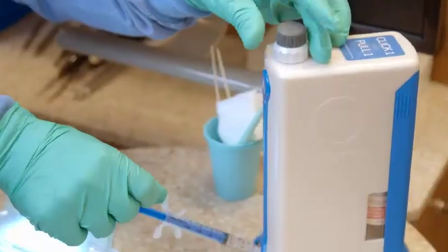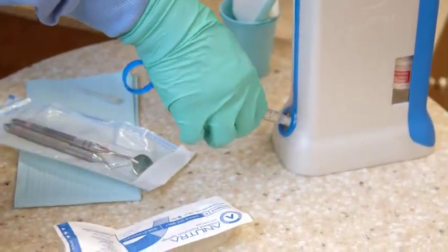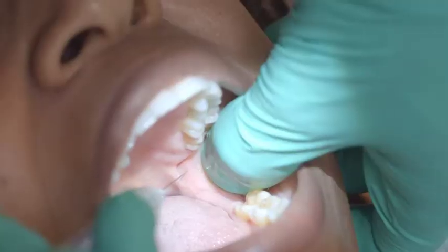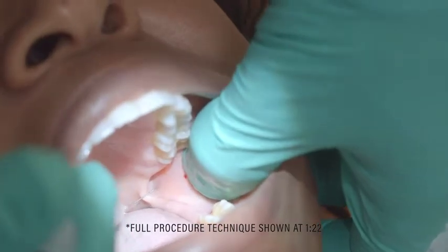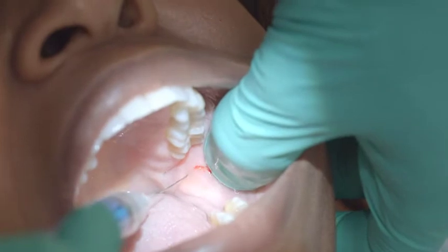One of the most effective techniques I've developed for an inferior alveolar nerve block is the combination Akinosi and Halstead techniques. The Akinosi is a technique traditionally taught as a closed-mouth technique, but I do it open-mouth while covering the same concept. I put my thumb on the anterior border of the ramus and my finger on the posterior border of the ramus — which we do for both blocks, the Halstead and the Akinosi. But instead of going in at the 90-degree angle we traditionally use, I run it parallel with the bone.